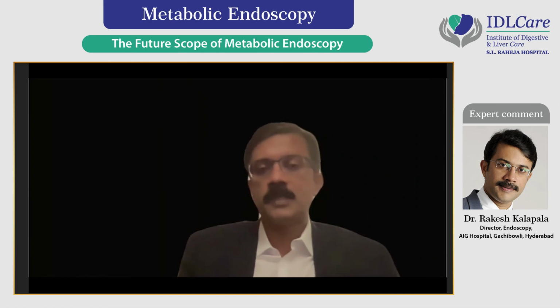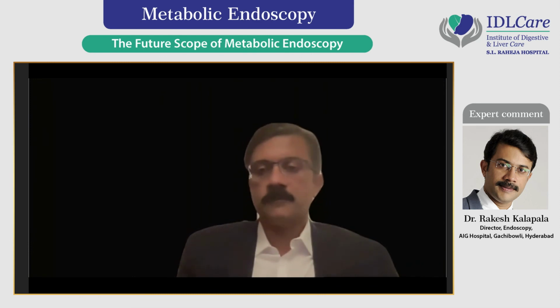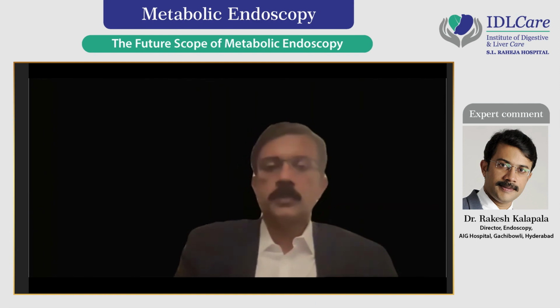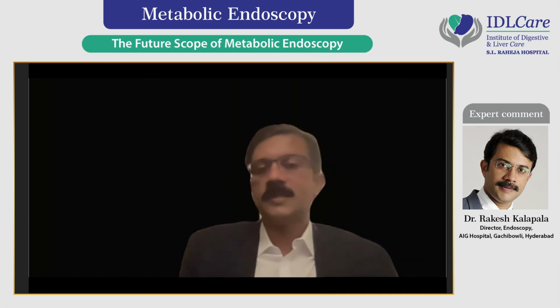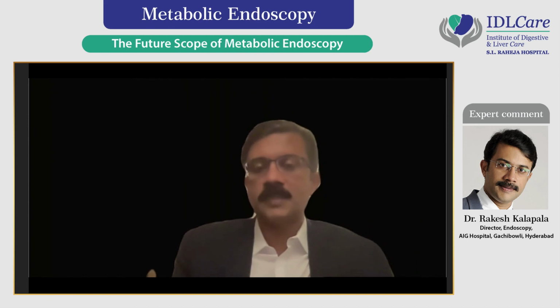And we have a personal experience with the duodenal bypass liner, which has got a fantastic outcome in the first animal experiments that we did. There's a little bit of migration issues which will probably be addressed in the next 6 months, and we are sure by 2022 or so we are trying to get into the commercial market. So that's an easily deployable device without any complications, which will address our people with diabetes. And as I told you, there is a 1.5 to 2% decrease in the HbA1c levels in all these people having good glycemic control.